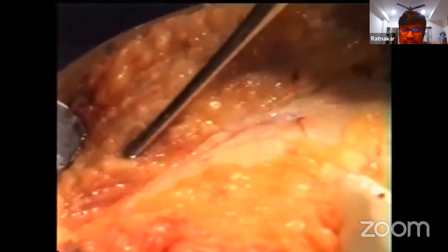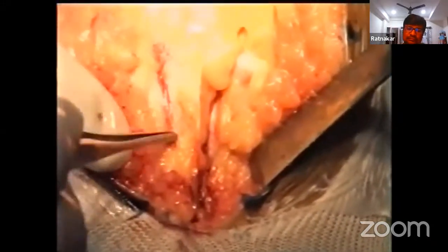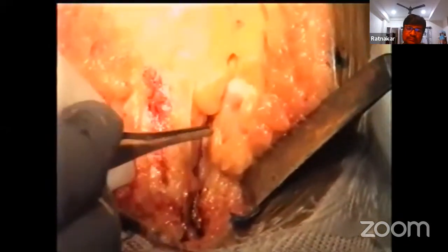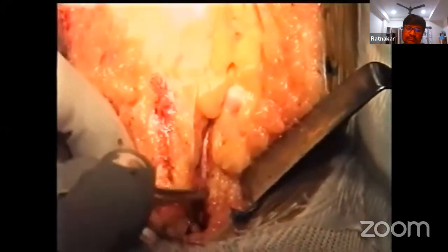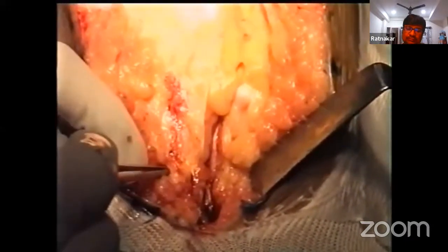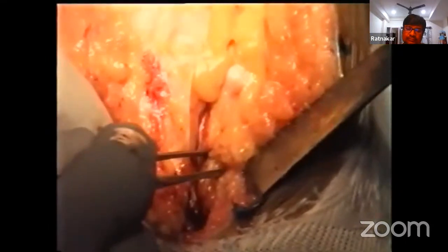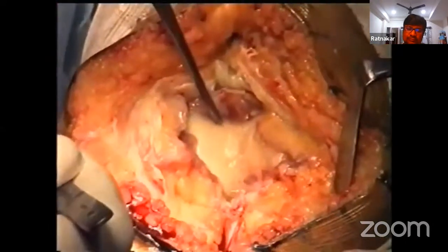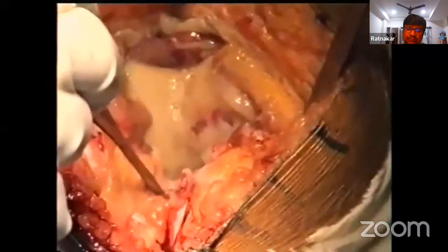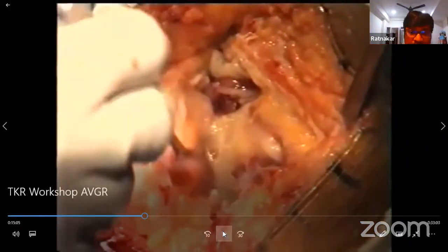It should be at the junction between the muscle and the tendon. When you come to the inferior part of the incision, that is the patellar tendon, and your cut should be medial to the tibial tuberosity. Or at the most, you can take a part of the cuff, but never transgress more than one-third on this side. That is the femoral condyle. You can see that is the top part of the tibia. That is the medial area.